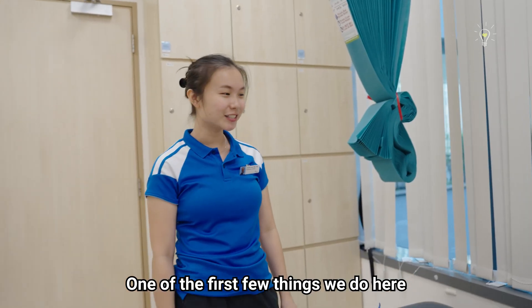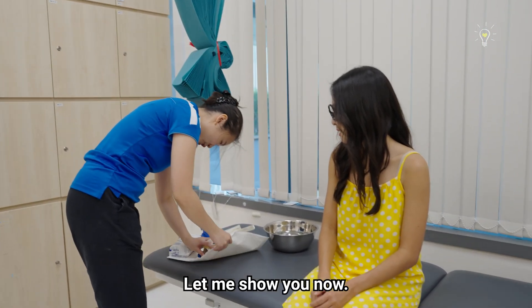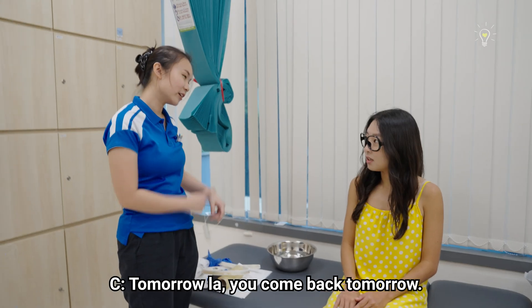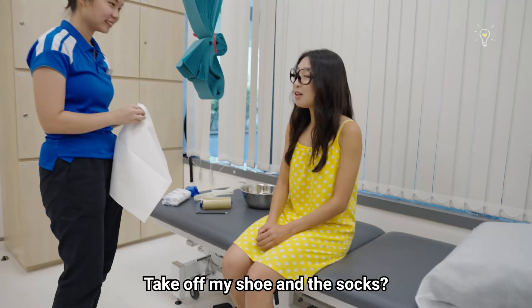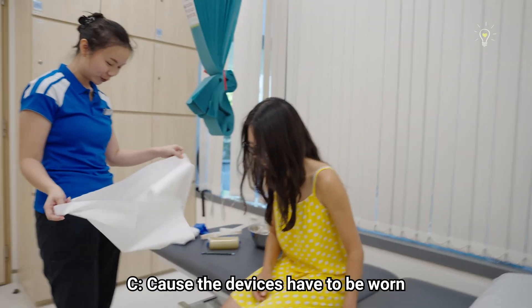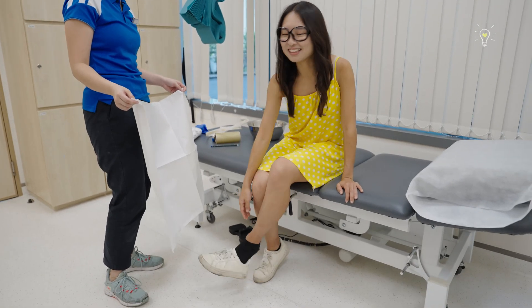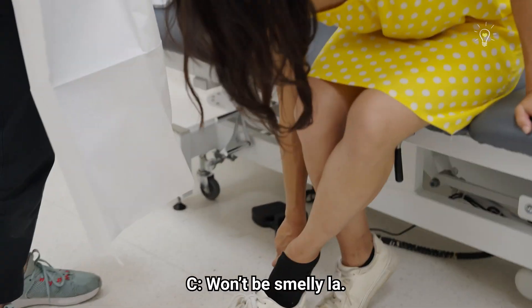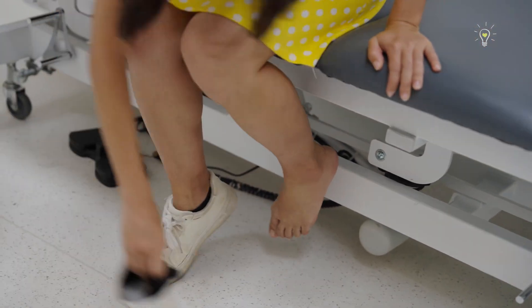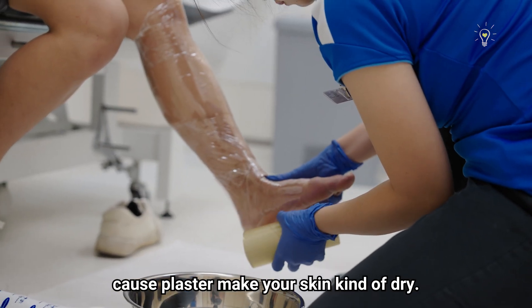One of the first few things we do here is to create a cast, so let's get cracking. Let me show you. Take off your shoe and socks, because the devices have to be worn against your skin directly. So first we have to protect your skin, because plaster makes your skin kind of dry.